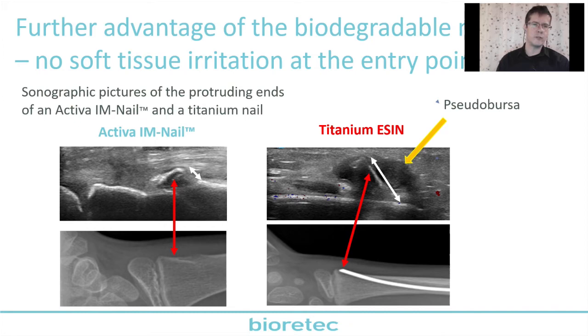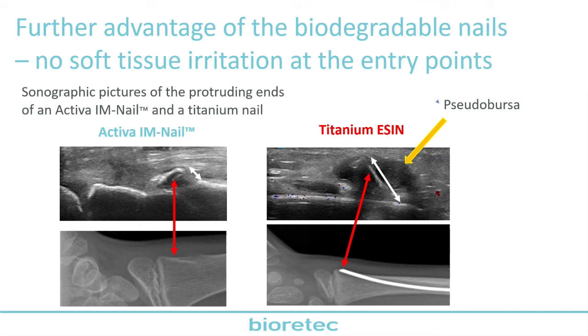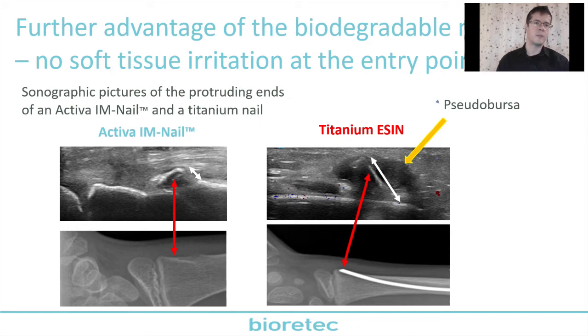There is almost 5 millimeters of titanium nail outside the bone, and we can see a pseudobursa around the bone. This is a finding we see many times when we remove the nail, and this is what usually causes soft tissue irritation or skin irritation, and this is why we sometimes have to remove the nail earlier than we have planned. And if we look at the ultrasound picture after an Activa nail, we can see that only 1 or 2 millimeters of nail is outside the bone, with no pseudobursa formation around the implant. It is indeed a very tissue-friendly implant.